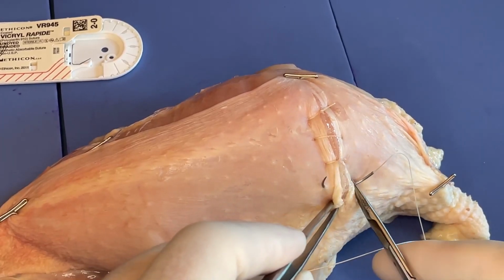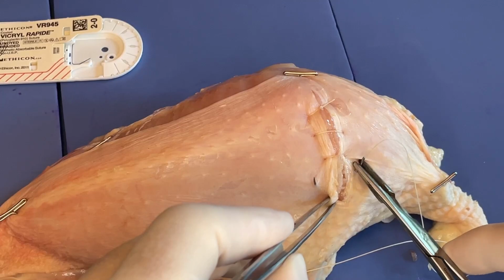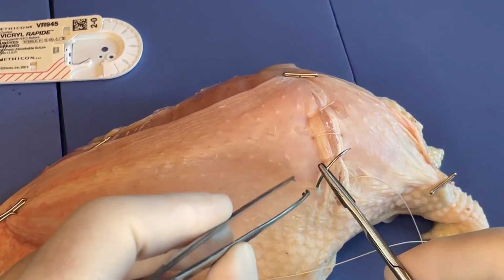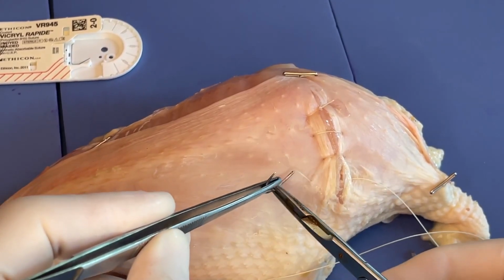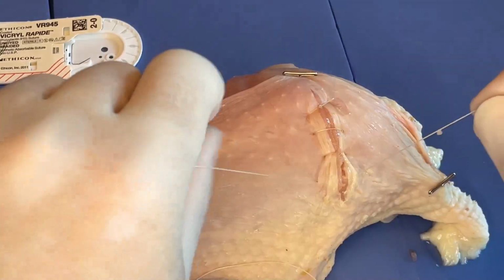You can go across in one pass in some instances. If you get to this point and you just have a little bit of the needle tip that's visible, you can just re-grasp over here, drive a little bit more of it through, stabilize with your forcep, and then you can rotate it out with the driver or with just the forcep itself. Grab, we're going to protect this. And again, thumb first for me.